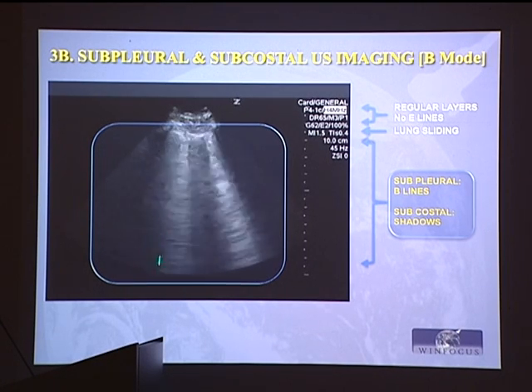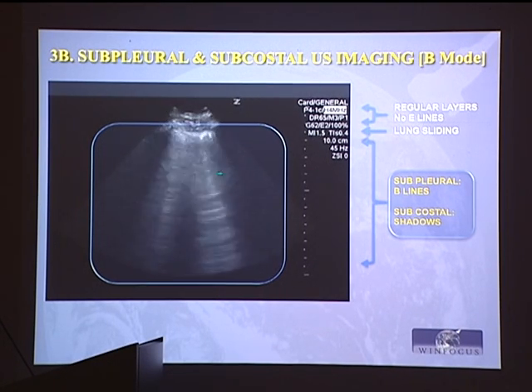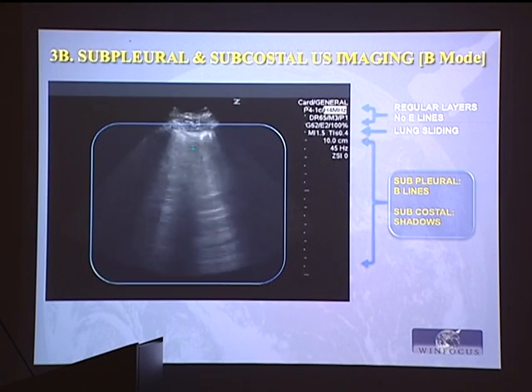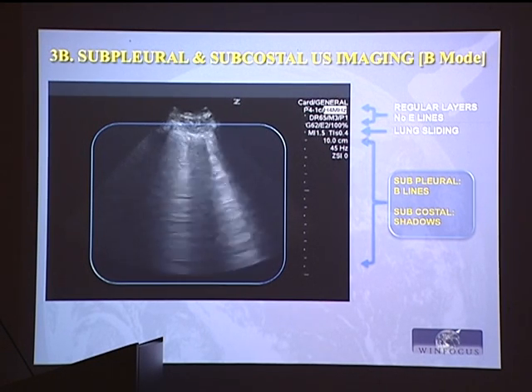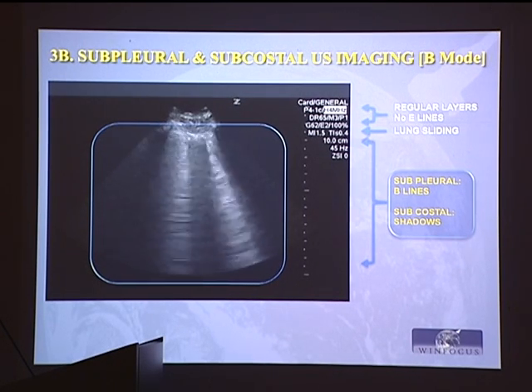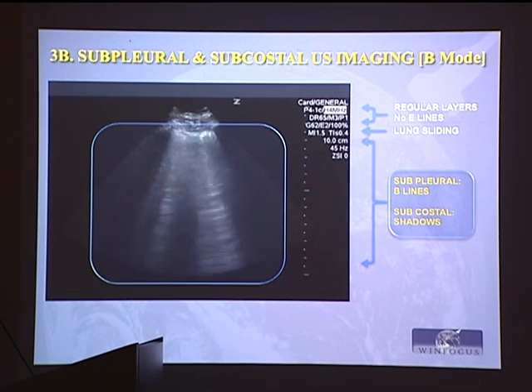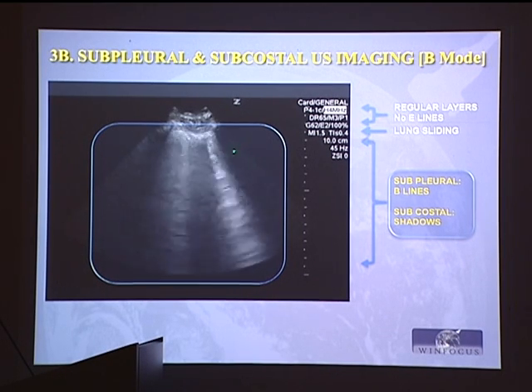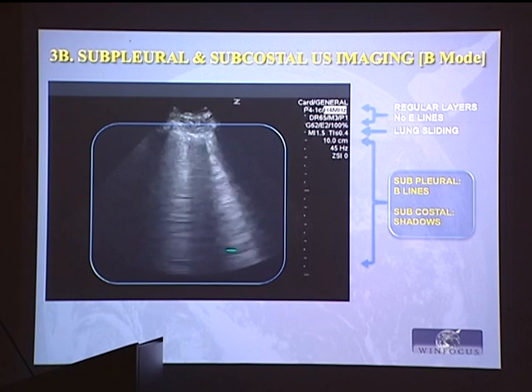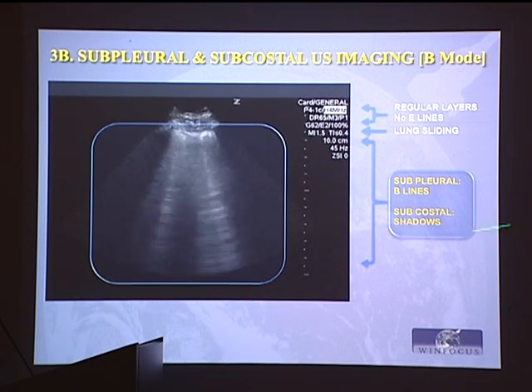So, how should we describe this sonographic image? No E line, do you agree? Is the pleural line regular or irregular? Here it is irregular. You see that it's thickened and irregular. So you will say irregular pleural line with sliding sign present, and B lines, suggesting what?